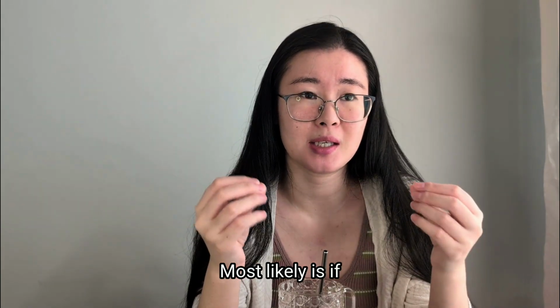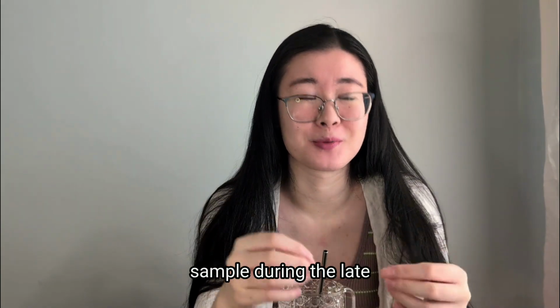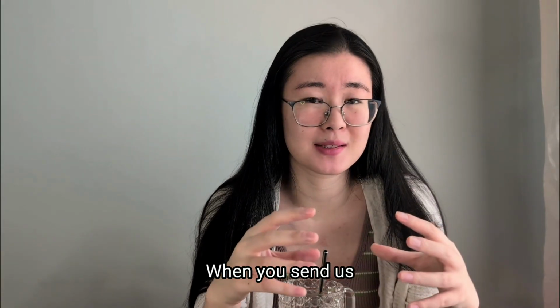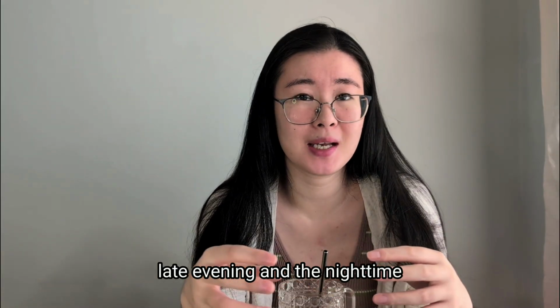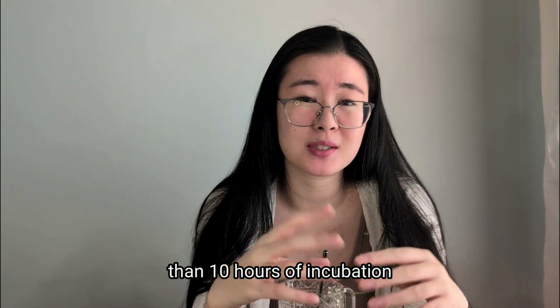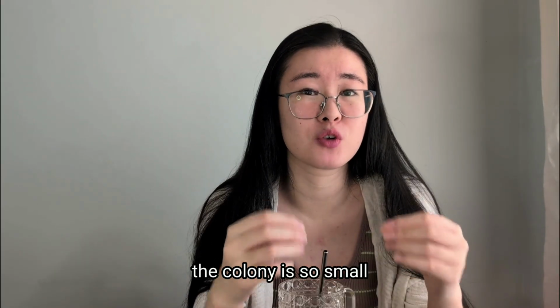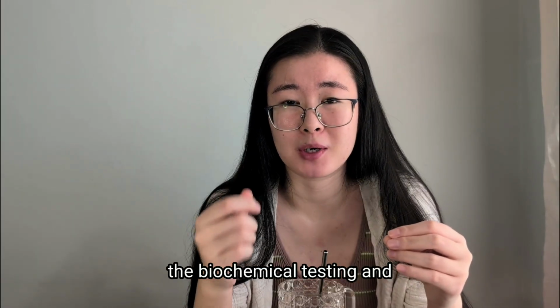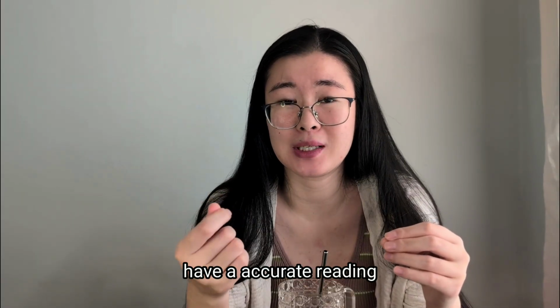Most likely is if you send us the sample during the late evening or during the nighttime. When you send us a sample during the late evening and the nighttime, very possibly after less than 10 hours of incubation, the colony is so small we can't really pick it up to do the biochemical testing and have an accurate reading for you.